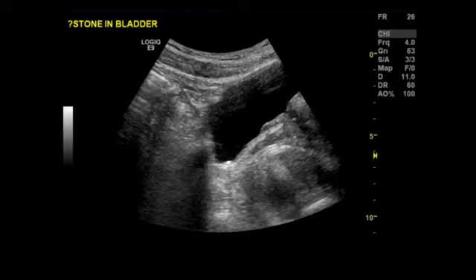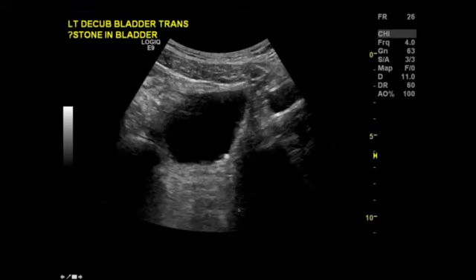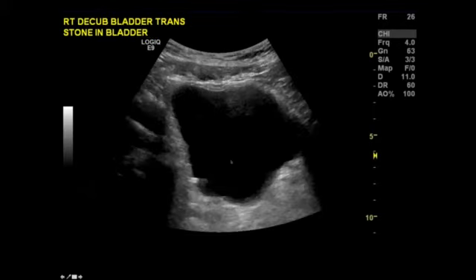Sometimes you see something else in the bladder, and here is a little stone with a little bit of shadow behind it, and you look at it and you wonder, could that be in a distal VUJ? Well, you can see that this is on the patient's left posteriorly, which is near where one of the VUJs lies, but this patient is lying on their left side. So if you roll them onto their right side, that stone which was here is rolled right onto here.